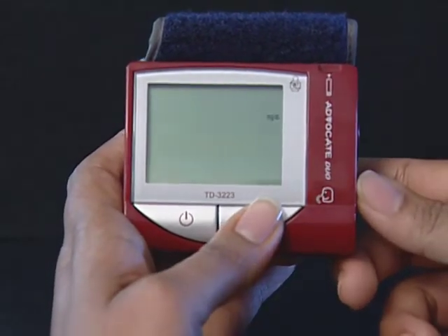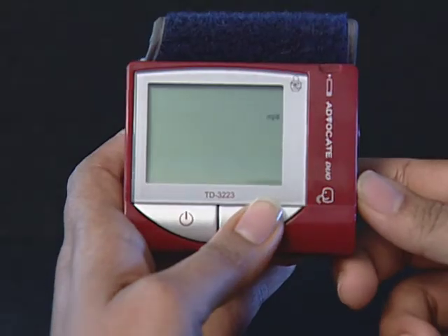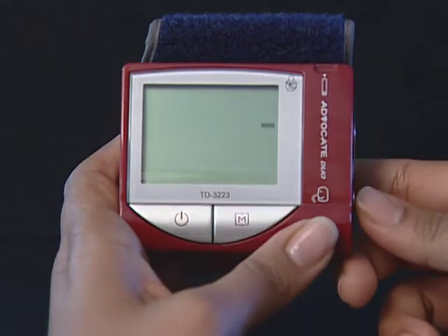Step 6: Select milligrams per deciliter or millimoles per liter (mmol/L). Milligrams per deciliter is standard in the United States. Millimoles per liter is the standard unit of measurement in Canada, Latin America and parts of the Caribbean. Press and release the M button to select the unit of measurement you want to use. Press the set button and then the current unit of blood pressure flashes.